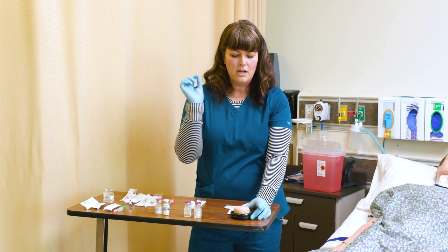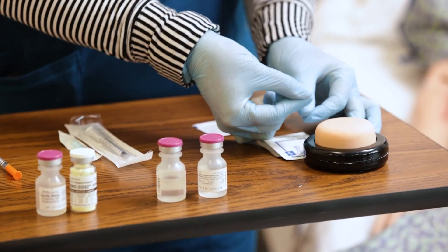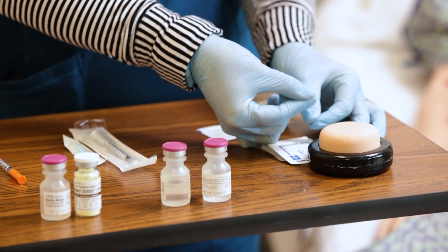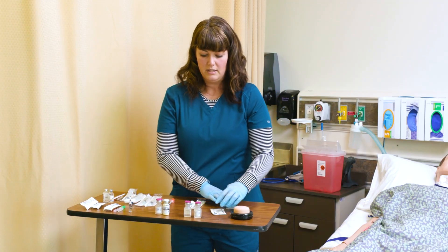The reason why we use such a small needle is because I'm not trying to get it all the way into the tissue. I am trying to create just a small bubble underneath the first layer of tissue, so I want something that won't go deep.